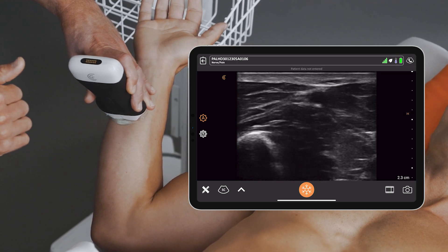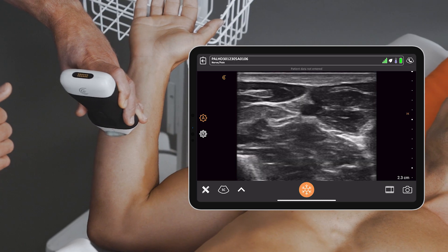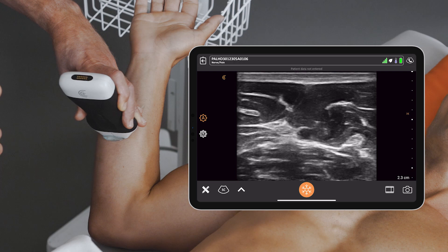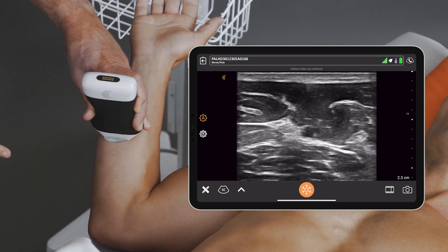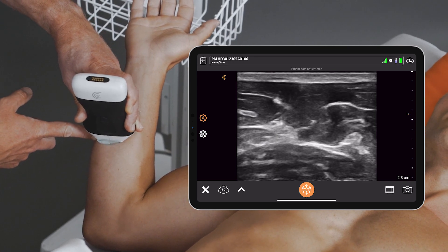I can optimize my depth and then follow those two structures up to a point where I feel reasonably confident that the artery has moved out of the way and I still have excellent access to the nerve. I'm going to put my needle in in longitudinal plane to perform the block, coming in from the ulnar aspect.